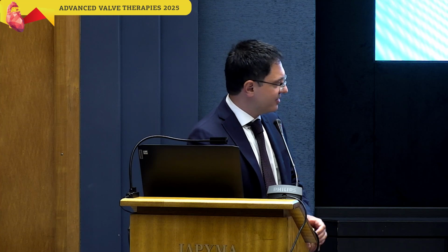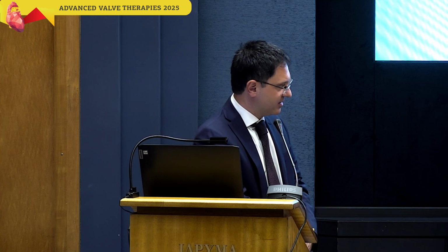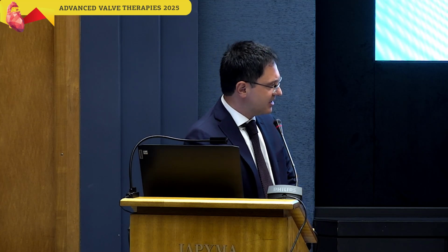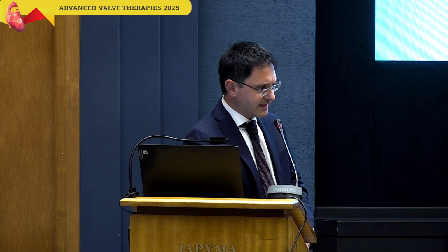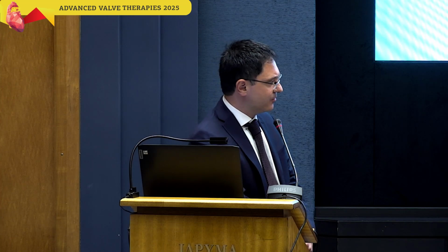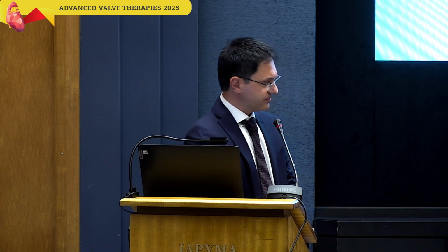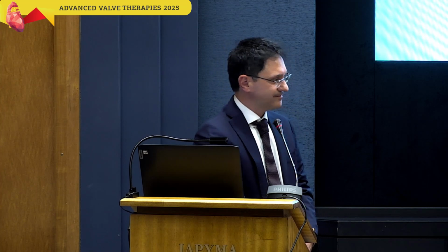Our experience is that in such cases we have to use devices with firm clasping, such as the PASCAL ACE. But as we mentioned before, I think a MitraClip would also have a good outcome in such cases. Thank you very much.